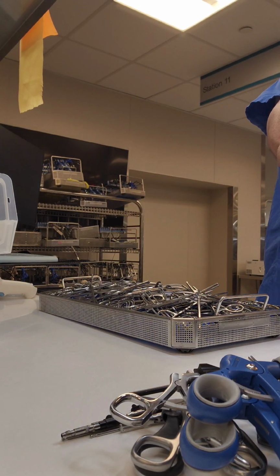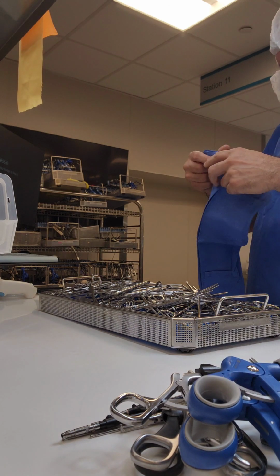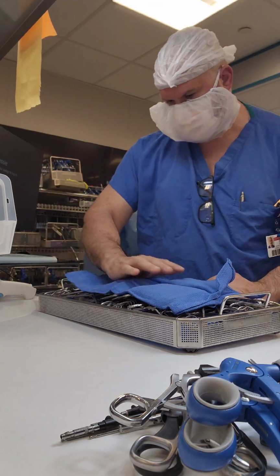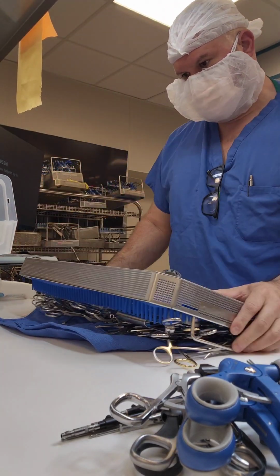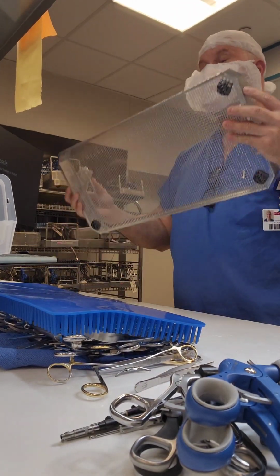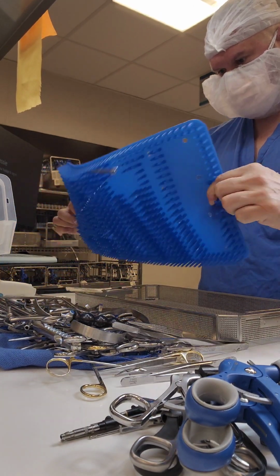All right, we're going to put a rack off to the side. Now, this laparoscopic instrument tray also has some general instruments. Now, if you guys know, I do not reach in baskets. I am a dumper, so I am getting all my instruments out of there, slightly dump it, make sure all my instruments are out of there, and then inspect the basket because that is a medical device.